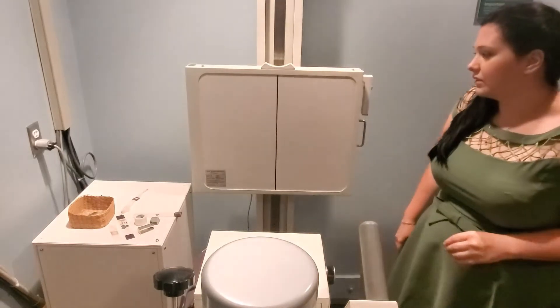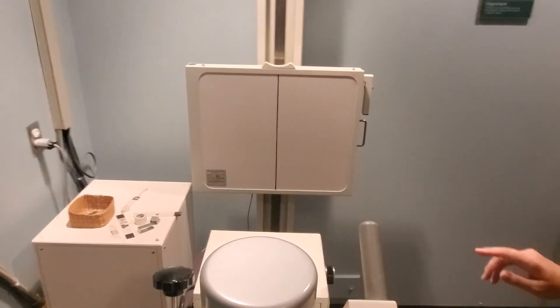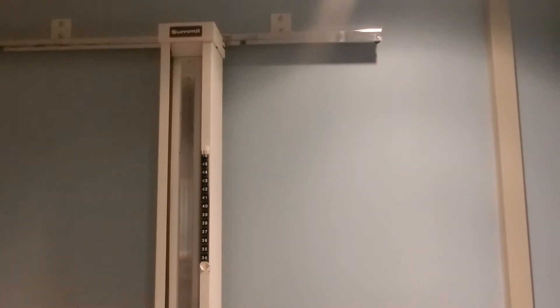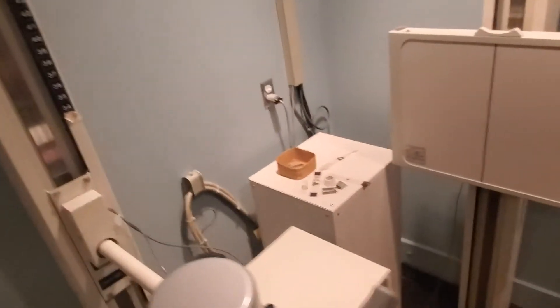With the upright system, you want to set your tube to be at 40 inches SID. They have this at the lab we'll be working in — if you look at the top at that runner there, that tells you the SID.